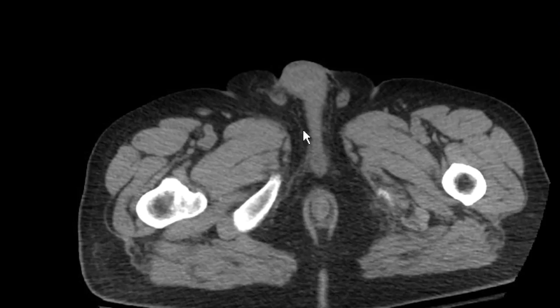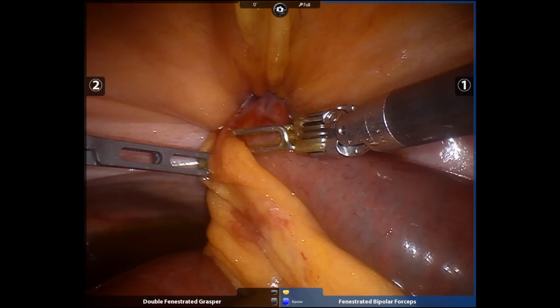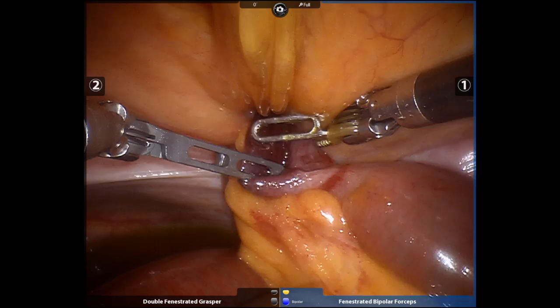General surgery was consulted, the INR was normalized, and the patient was brought to the operating room. In cases where bowel handling is necessary, I like to use a low grip strength double fenestrated grasper with my left hand, and a fenestrated bipolar with my right hand.